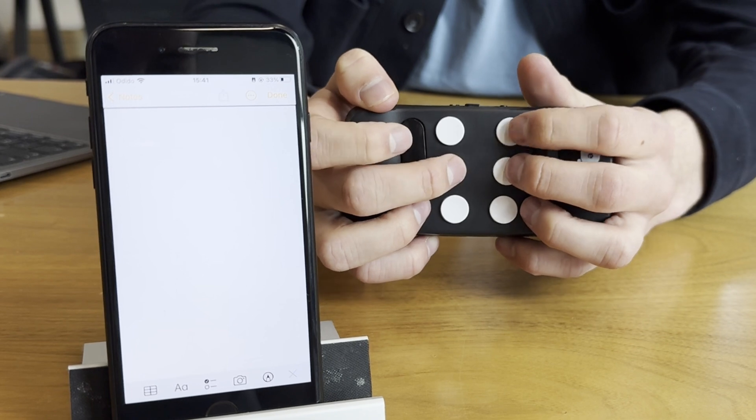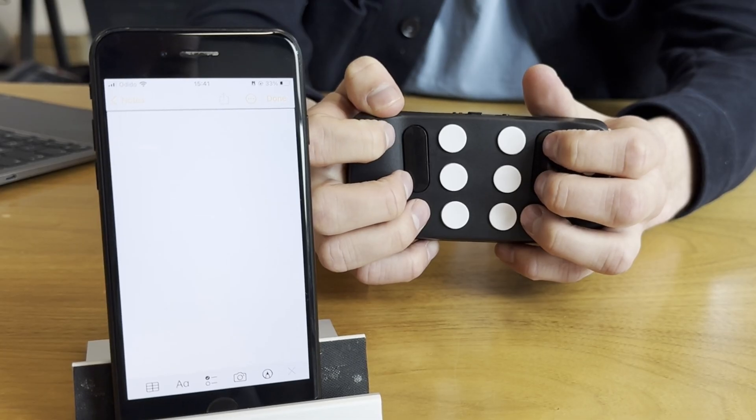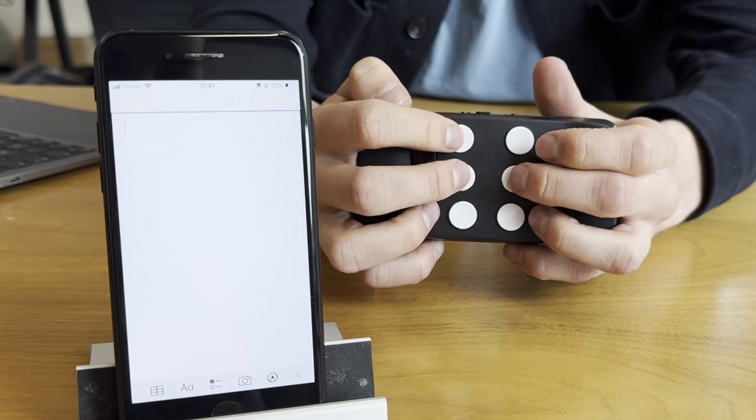Then we move to H — a button you'll use a lot because you can also use it to go back to the home screen. Button H is button one, two, and five at the same time. The I is the opposite of the E, so it's button two and button four at the same time. And the final letter we need to learn is J, which is button two, four, and five at the same time.